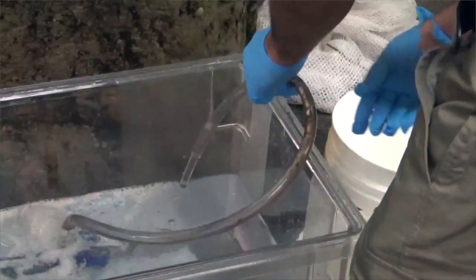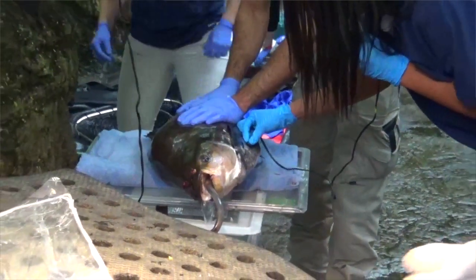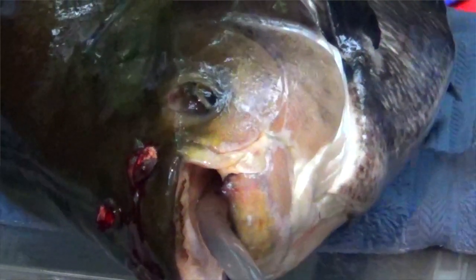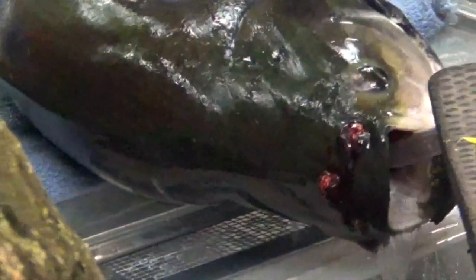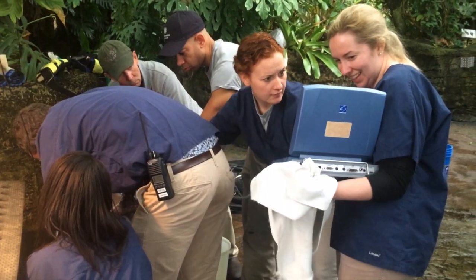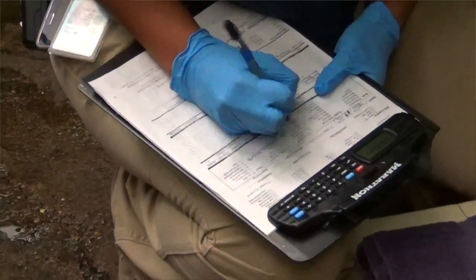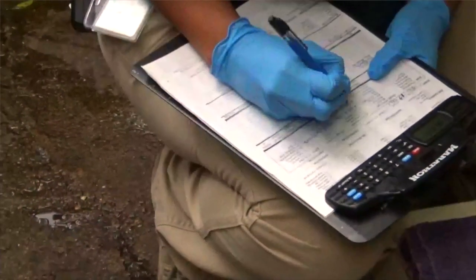To maintain anesthesia, we created a recirculating system with a pump, and through that pump we placed a tube into the mouth of the fish and recirculated anesthetic water so that it wasn't feeling any discomfort or pain. We did a procedure called an incisional biopsy where we took a large portion of two of the masses to get histopath — a diagnosis through the microscope — to determine whether the mass is infectious, inflammatory, or a tumor, so we could then dictate where we proceed with treatment.